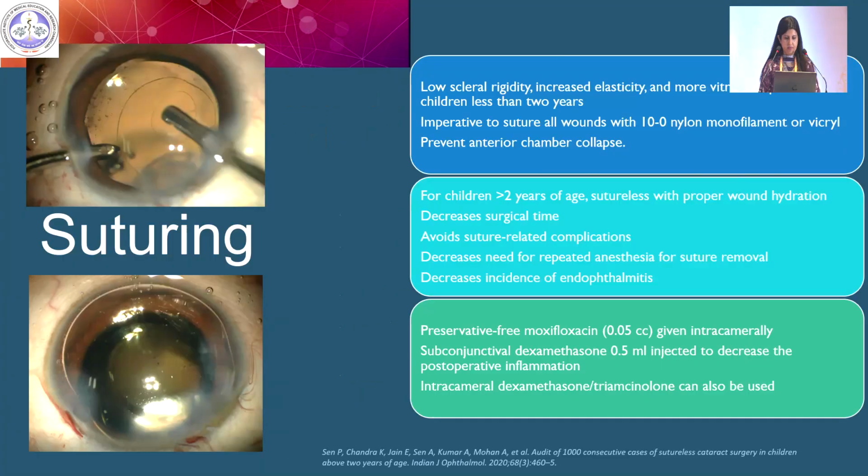Suturing should be done in children less than 2 years of age, as there is low scleral rigidity and increased elasticity, and there is a chance of wound gape. It can be done with 10-0 nylon or a Vicryl suture. And finally, a preservative-free moxifloxacin should be given intracamerally.